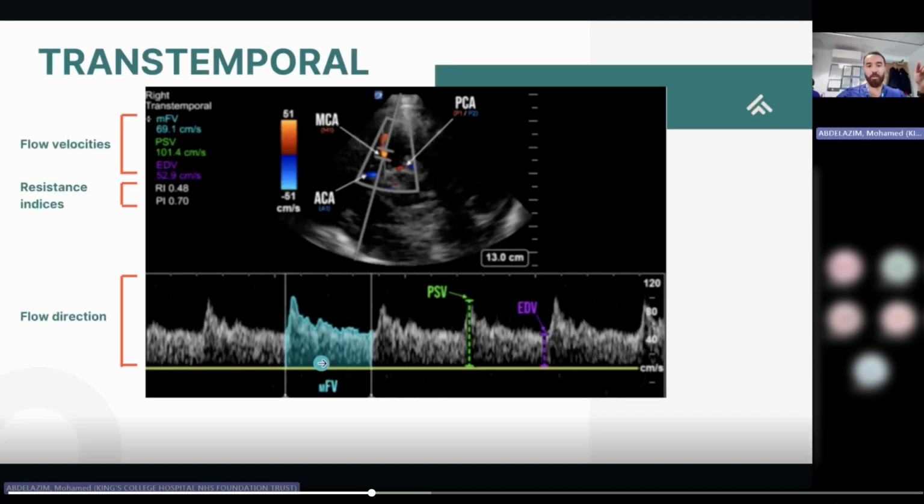As you can see, this constitutes one cardiac cycle, and its components are, one, the systole, which ends somewhere here, which is a sharp systolic spike, and then you get a beautiful slow diastolic deceleration, as you can tell from here, and it starts somewhere here and then goes all the way until the end diastolic velocity. And obviously the peak of this is the peak systolic velocity. And the mean can be obtained automatically by the machine itself.